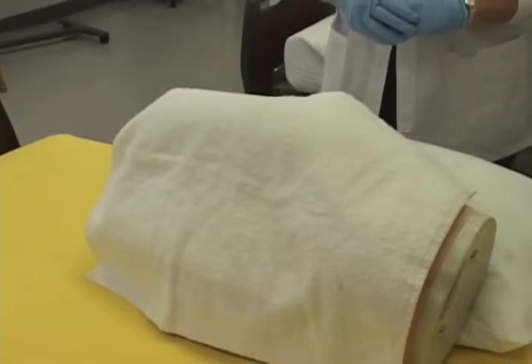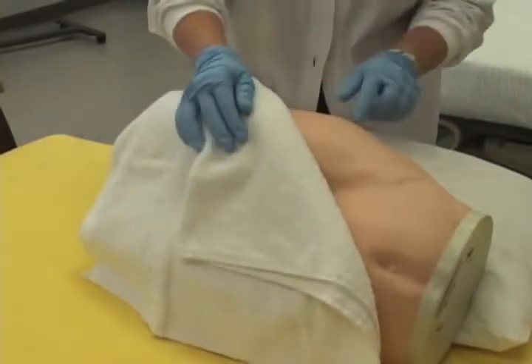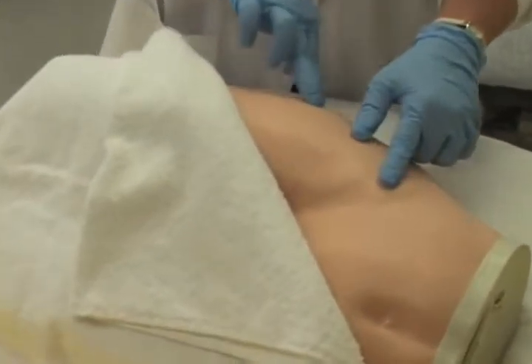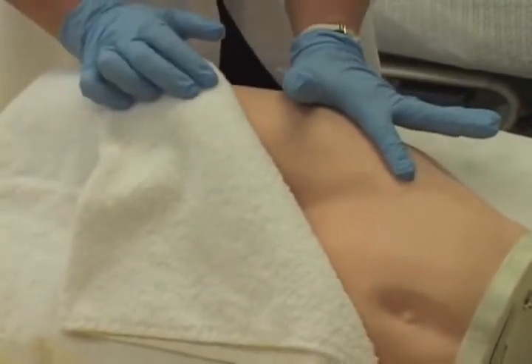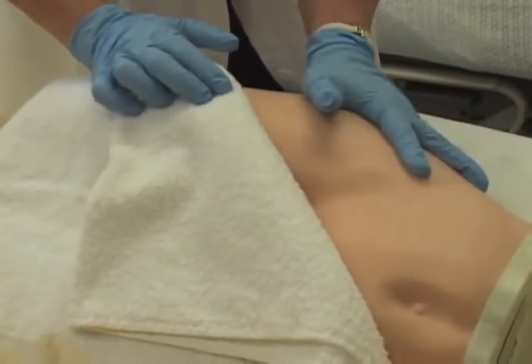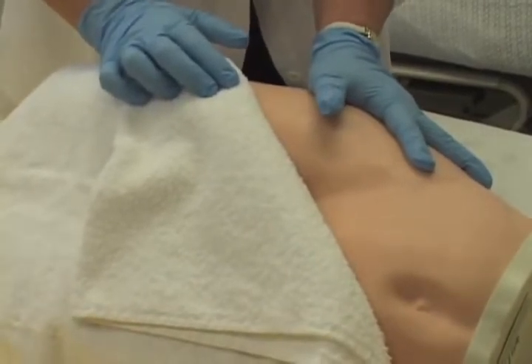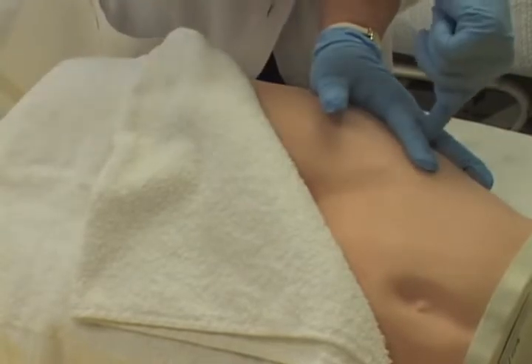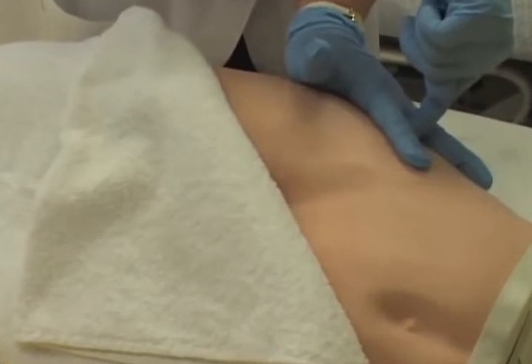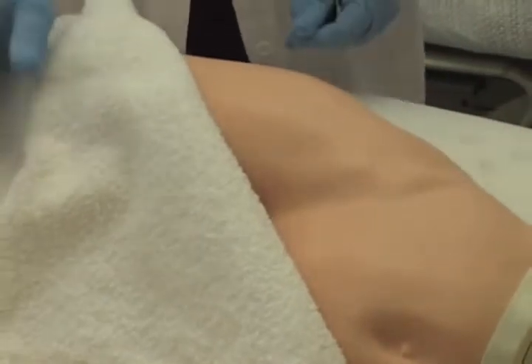Now we'll demonstrate the ventral gluteal site. You'll locate the anterior superior iliac spine and the greater trochanter. So you put your index finger on the anterior superior iliac spine. Your palm will kind of fall in the vicinity over the greater trochanter. Then you're going to spread your fingers back towards the iliac crest. Your injection site will be in the V. Please note that when using the right hip, you use your left hand to find the injection site, and if you're giving the injection in the left hip, you would use your right hand.